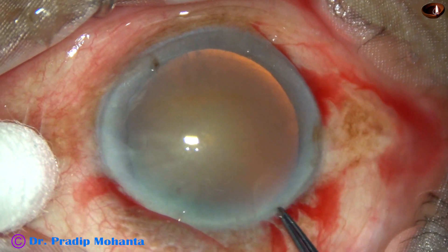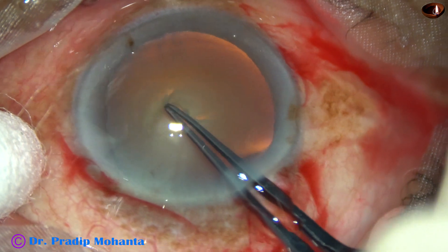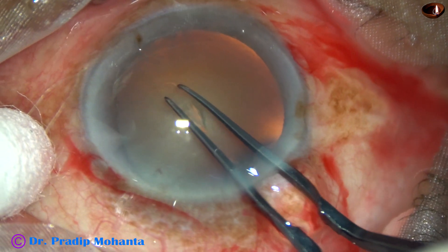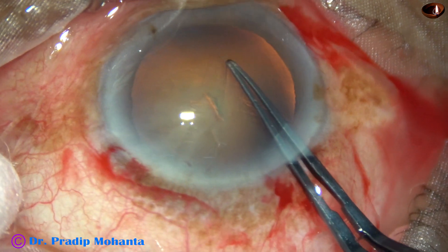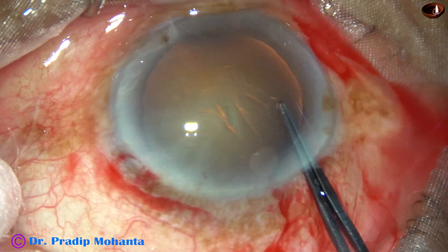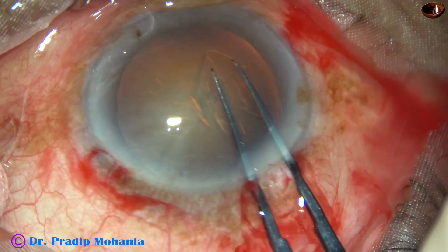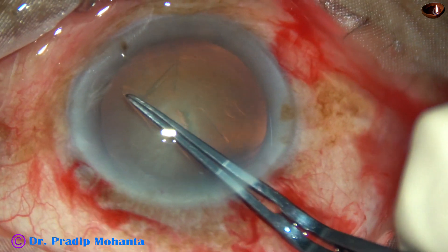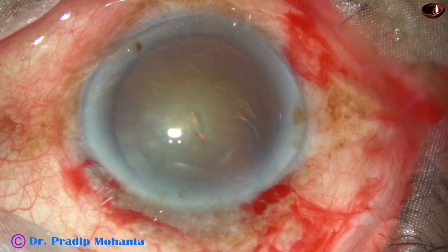Now a Utrata forceps is taken, a puncture is made on the anterior capsule. A capsular tag is raised and this capsular tag is held with the forceps. Going anti-clockwise all around, remaining at a certain distance away from the margin of the dilated pupil, a continuous curvilinear capsulorrhexis is performed.